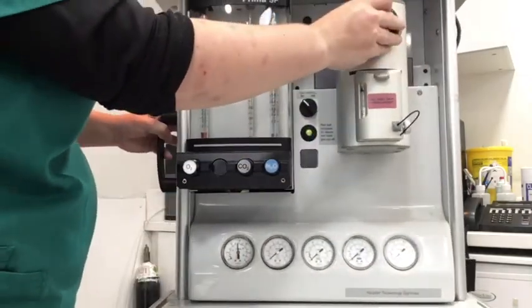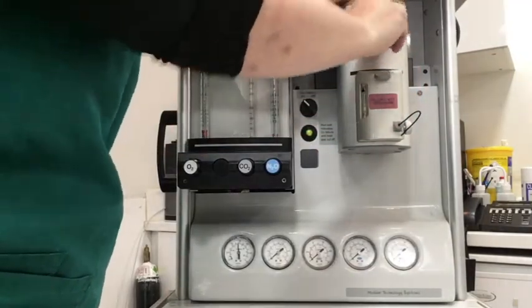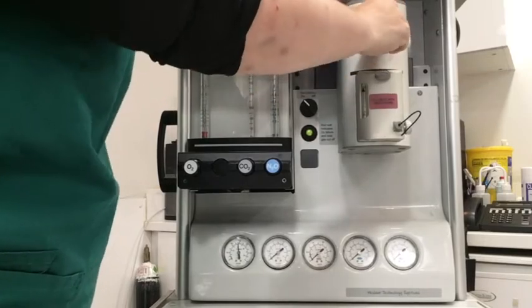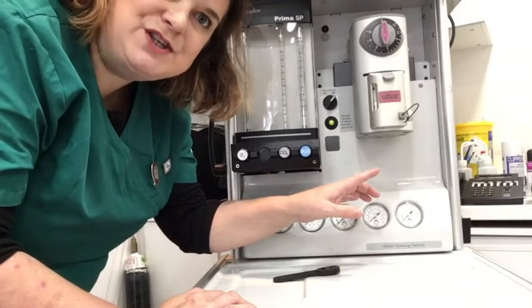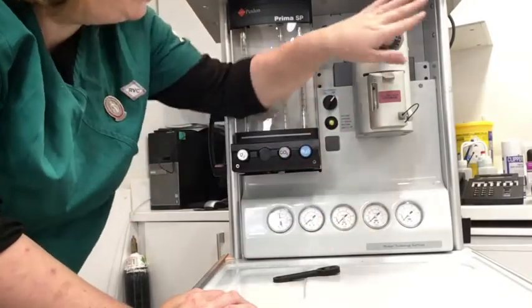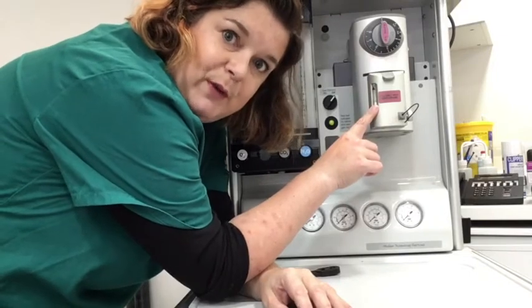This is our gas. This one is isoflurane, but you could get other types. Push in, check to five, and it works smoothly. A check here is: once we have checked this, we want to look and see how much isoflurane we've got.